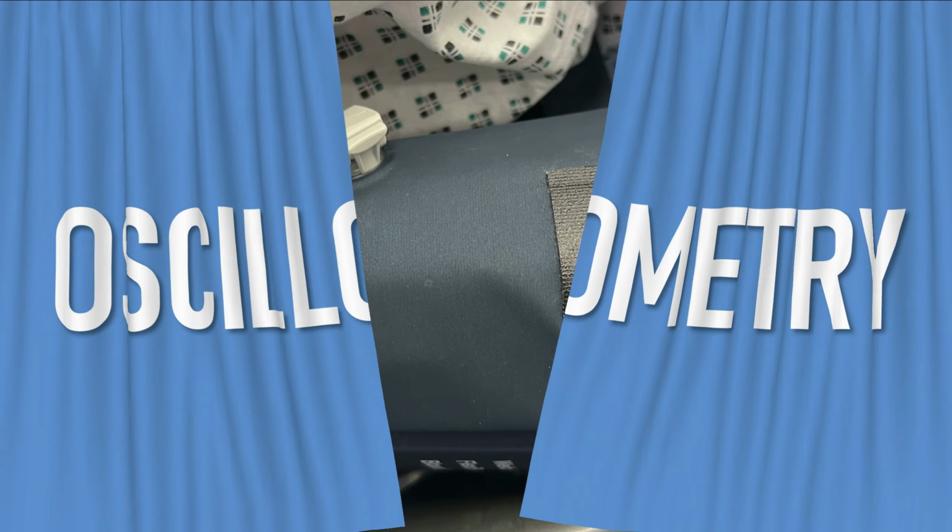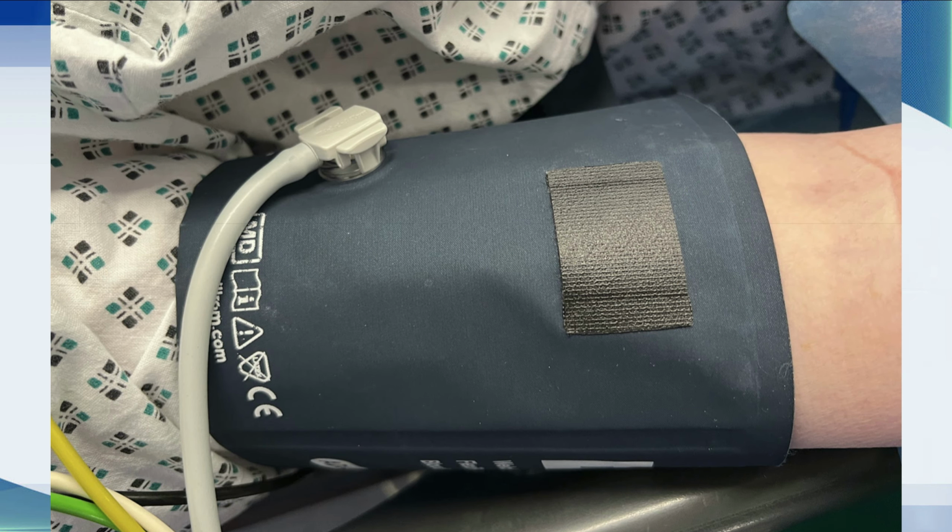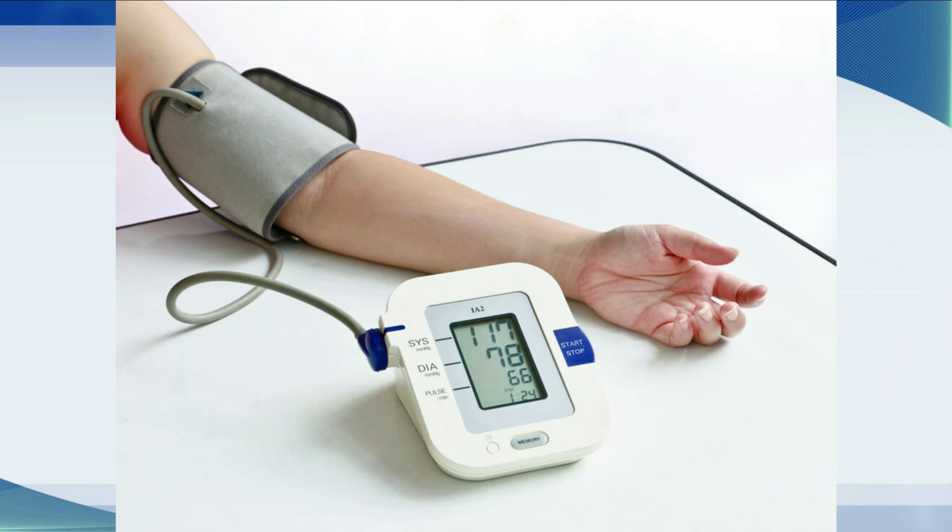But it's not the only way that we measure blood pressure in hospitals, because this is what you usually see on the vast majority of patients on the wards, in the ICU, and in the operating rooms. And it's known as a blood pressure cuff attached to an oscillometer device. You may also have one of these devices at home, because these are now being sold as consumer devices for very modest sums of money.